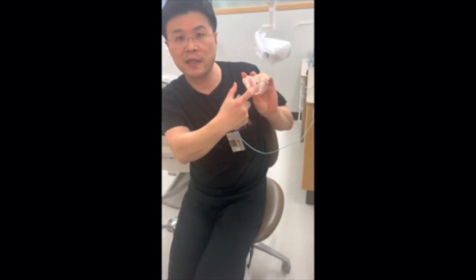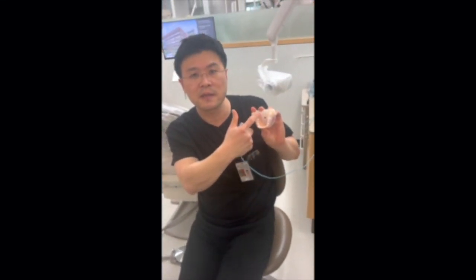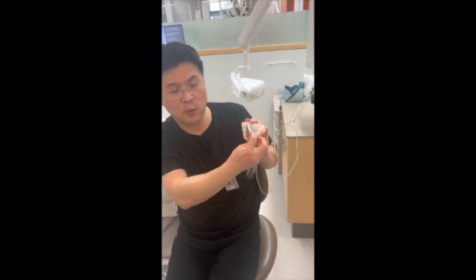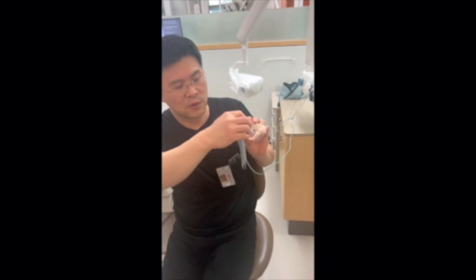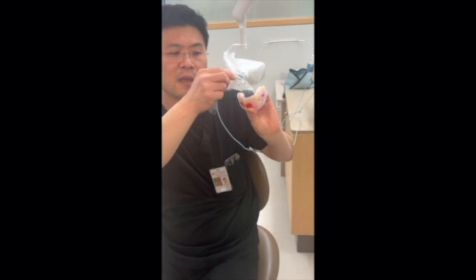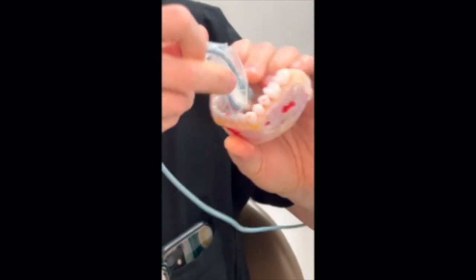Lingual tori can make it difficult, as can a very large tongue. You can't necessarily place it right next to the teeth. However, you can place it vertically. Again, you may need to rotate it, and then go ahead and capture the radiograph.